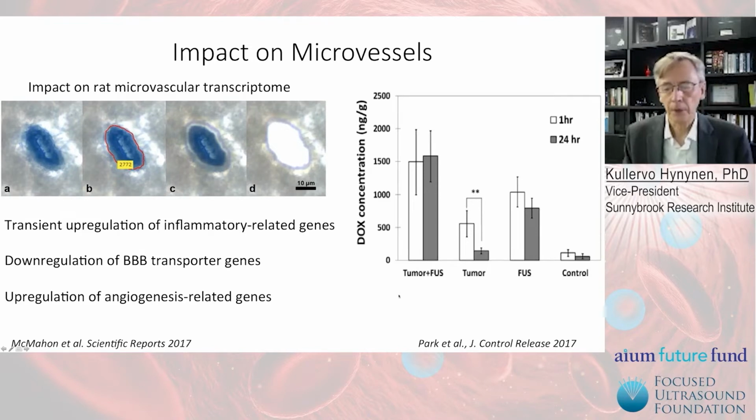And this was studied by others, Park et al., where they showed that in tumors sonicated with ultrasound and microbubbles, the drug concentrations stayed the same at 1 hour and 24 hours, whereas in tumors that were not sonicated, there was an efflux of the drug.